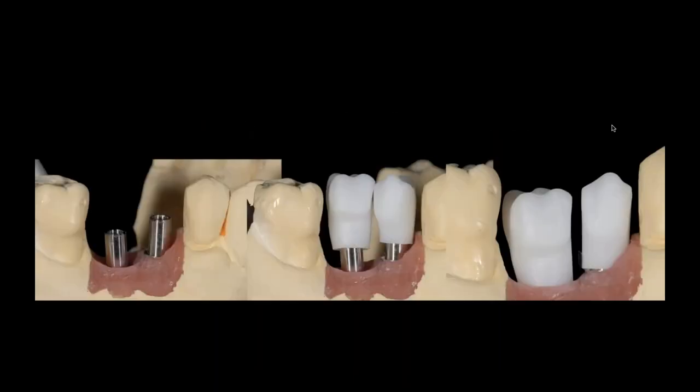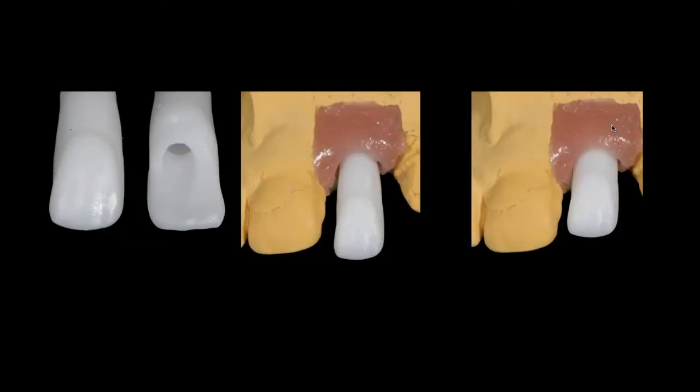So for a long time, we did a lot of double scanning, where rather than designing in three-dimensional space, we were just doing a quick wax-up and then double scanning it. We don't really do that so much anymore because the software has really gotten better and better, and we've gotten more and more comfortable with the process. But I'm not afraid to do that, especially with abutments and certain implant cases, if I need to, because like everything, there's a pro and a con. There's a pro and a con to hand building something, and there's a pro and a con to machine building something. And we need to understand all the aspects of that so we can make what's best for the patient in the substructure and in the final restoration.